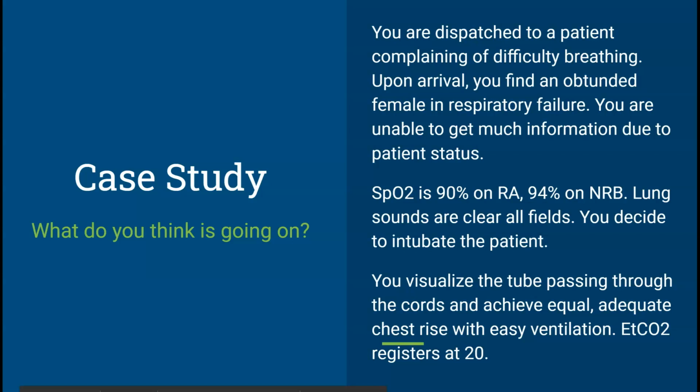Yes, perfect. So is she hyperventilating basically? She's just breathing too quickly? There's a possibility. There you go. Diabetic ketoacidosis? No, not diabetic ketoacidosis. You would expect her end tidal to be much higher. Your normal end tidal range is 35 to 45. If she was in diabetic ketoacidosis, you would expect it much on the higher end. Just like if you had air trapping, like from asthma or COPD, you would expect a higher end tidal.